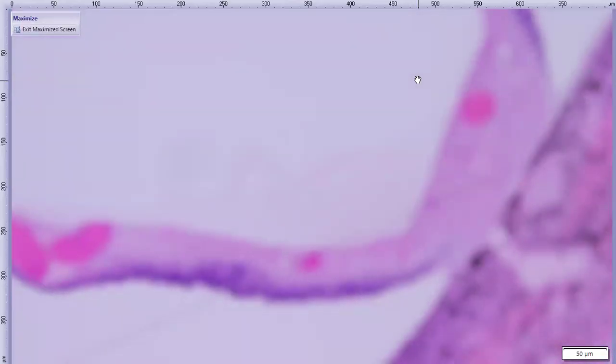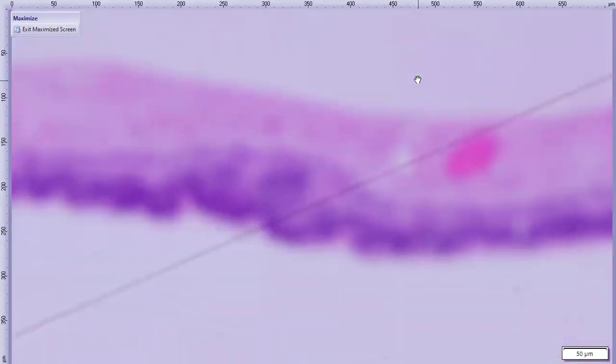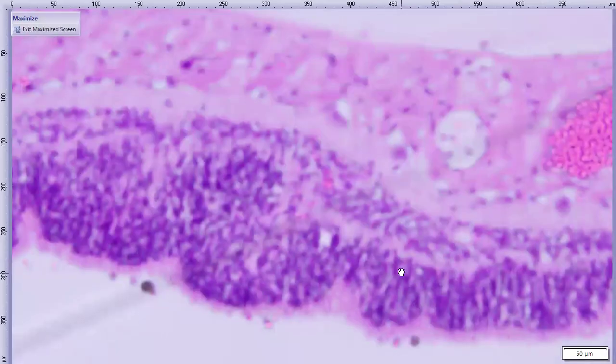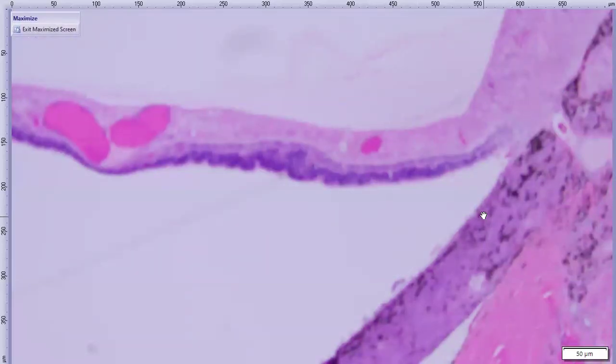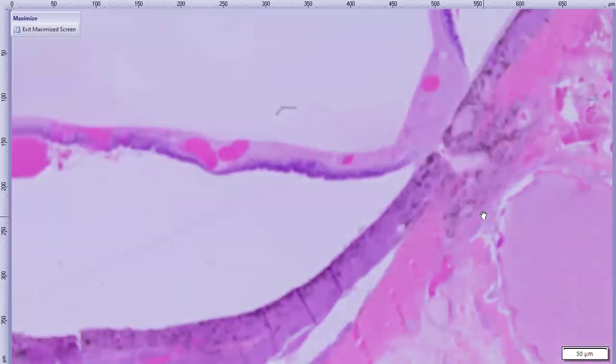At this point, I would say as far as the actual retina itself goes, in order to confirm that, we have shortening of the photoreceptor inner and outer segments. So some people call these the frilly frills. The pink frilly frills should be longer, and they're sort of short and clubbed here. So that's an indication that the retina is truly detached as well, because those are the things that will begin to degenerate the most quickly after retinal detachment.